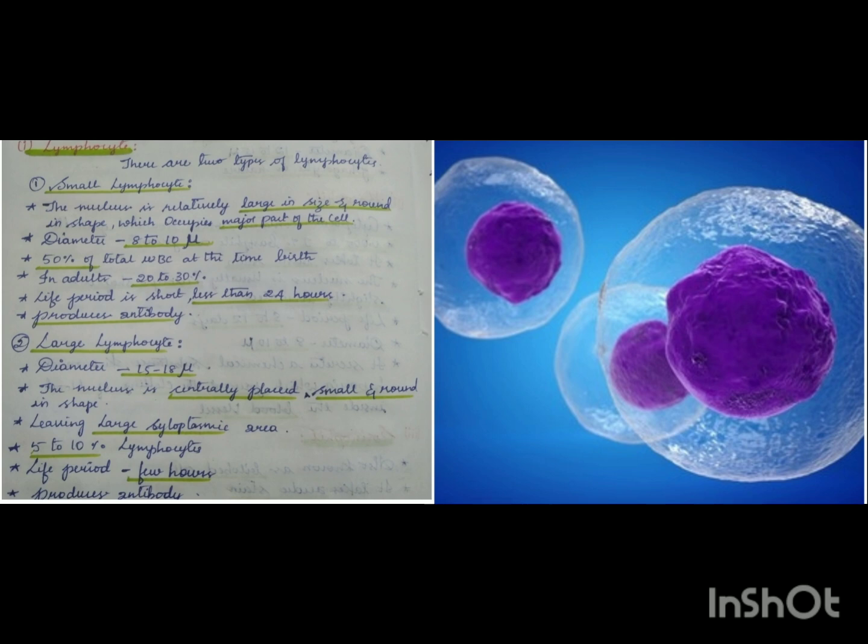Small lymphocyte. The nucleus is relatively large in size and round in shape, which occupies major part of the cell. Diameter is 8 to 10 microns. It is about 50% at birth. In adults, it's 20 to 30%. Lifespan is too short, less than 24 hours. It produces an antibody.